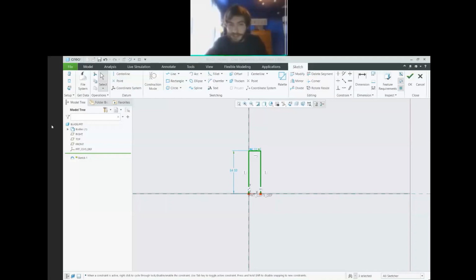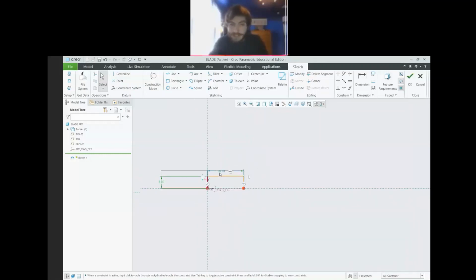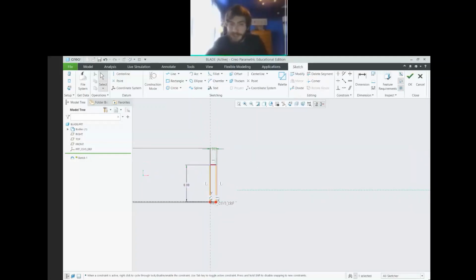So here we'll pretend this is 6 inches. You see how it kept this 18; it doesn't keep the same scaling that it was. And we'll say that it's an inch apart. So you can see that this is the side view of the top portion of that Cheetah blade, the piece that would attach to what's attaching to the nub, if that makes sense.